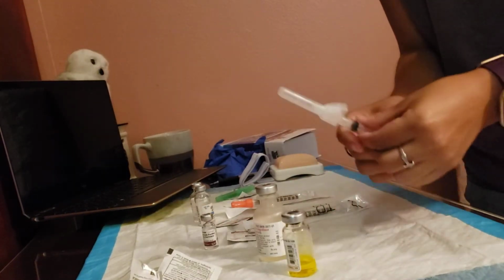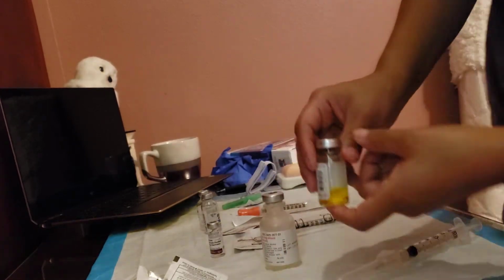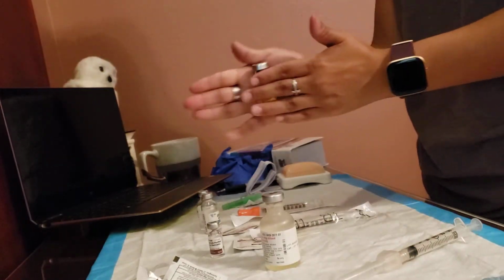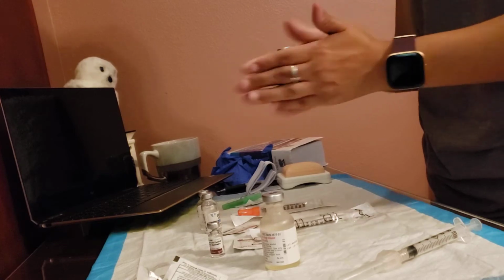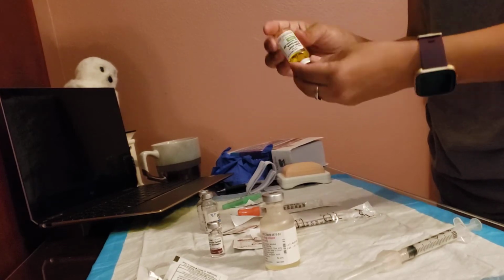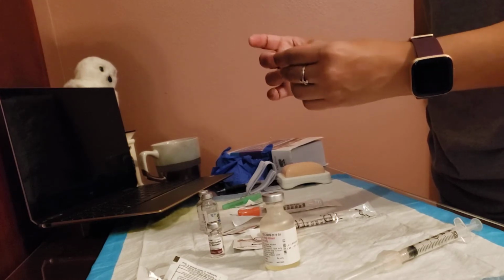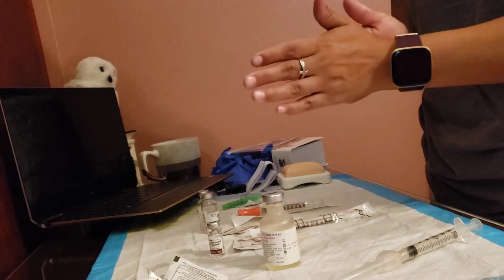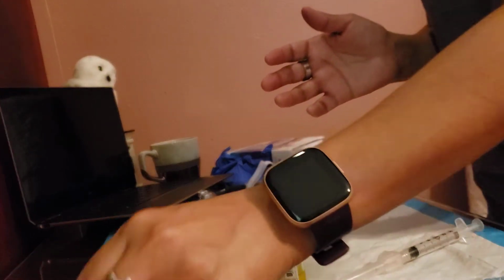Okay, so I've poured my 2.5 in here, and I'm going to do this here. I don't want to shake it off or anything. I want to just swirl it around, and go up and down, really gentle, to make sure I get all my powder in liquid form.